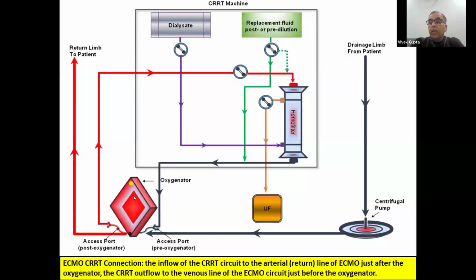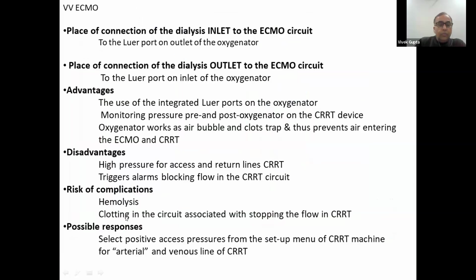The only problem is that because of these pressure differences, the quality of the oxygenator may be compromised, and your oxygenator may get clogged early and need a replacement, because it's a costly oxygenator. So you have to be careful. Otherwise, this is a good combination for CRRT or dialysis, any dialytic therapy using this combination.